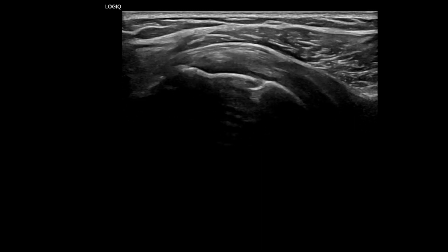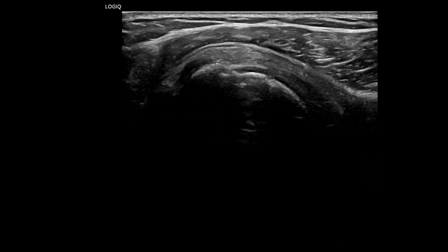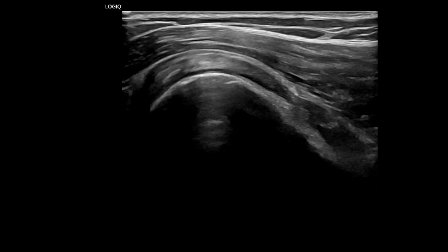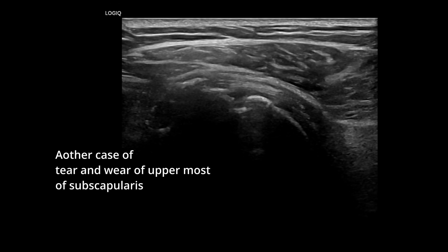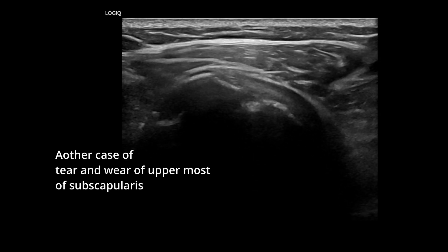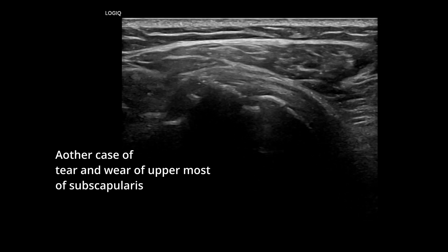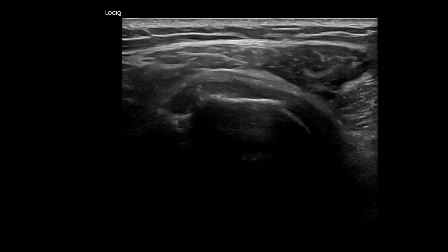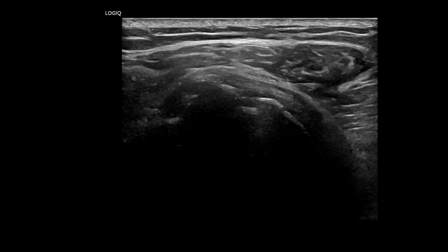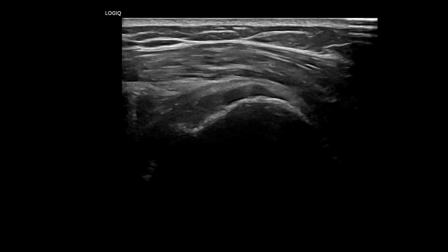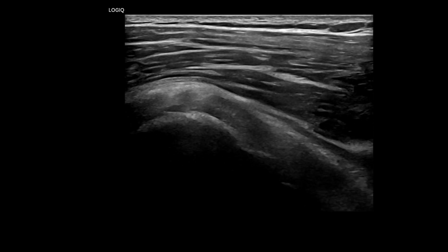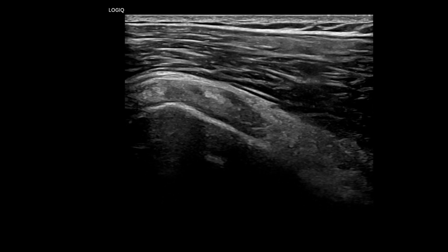Such tears at the uppermost area are prevalent among golfers, arising from backswing motions and impingement between the coracoid process and the lesser tuberosity. During the scan, measure the tendon size, assess the echo texture, and check for any signs of calcification or tears from the uppermost to the lower border, scanning the full length of the subscapularis.